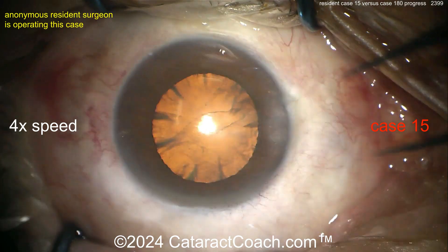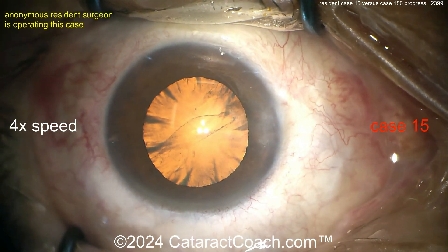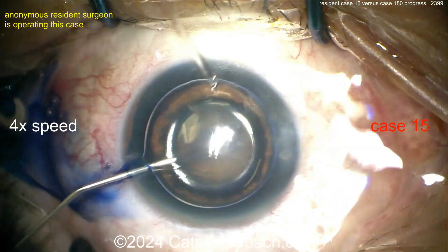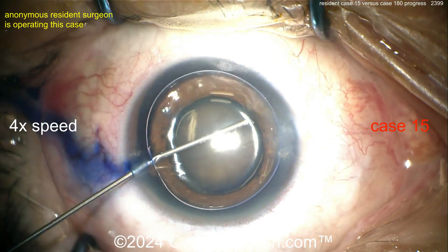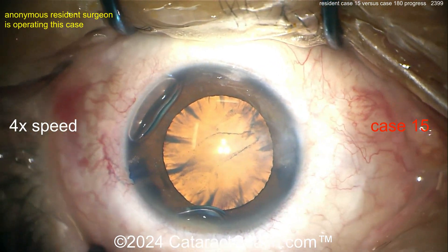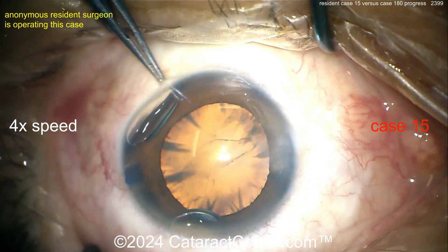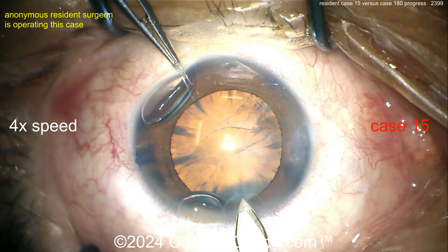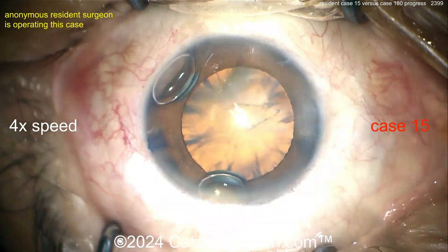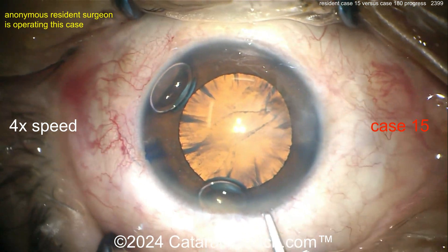There's one para, there's another. I like the draping, I like the eye positioning — eyes in primary look at the three lights in the middle. The lights from the microscope are nice in the center of the cornea. There's trypan blue dye, good injection of viscoelastic. This is fantastic for case 15. Let's see the incision — a little bit too much in the clear cornea for me.